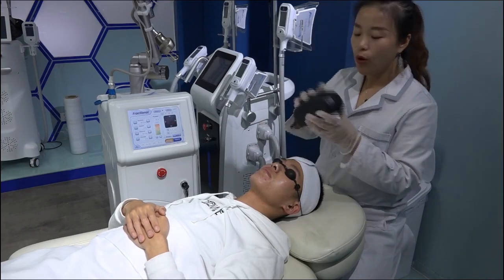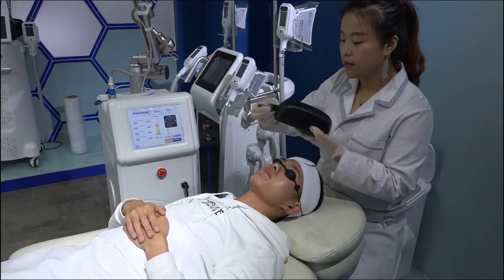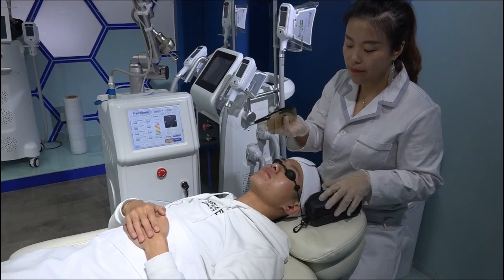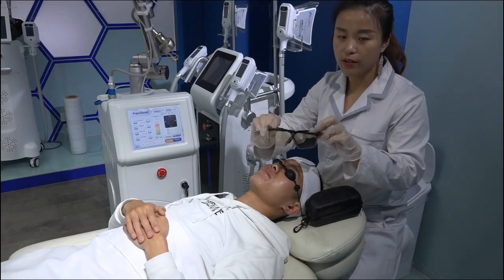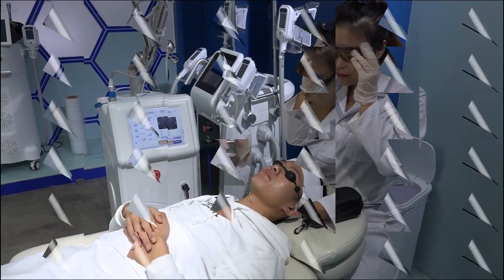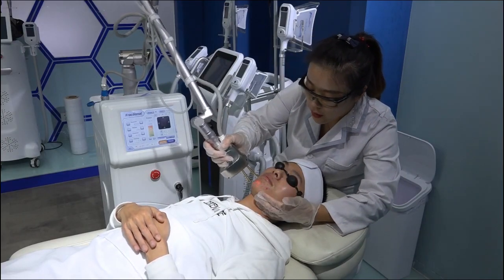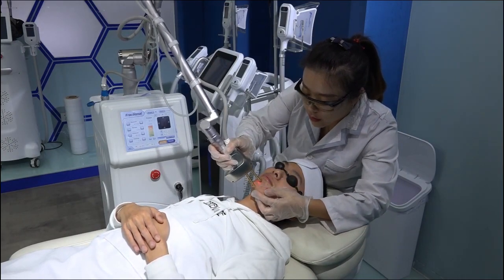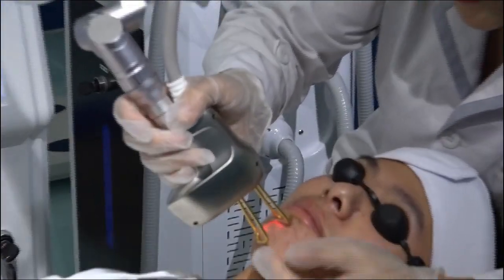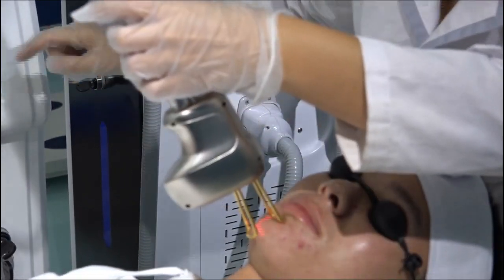Also, we will send you the goggles for CO2 laser with the machine. This one is special for CO2 laser. You can wear this. Because we will do the acne treatment here, you see, we have a light that shows you the treatment area. You can adjust the area. Hold the hand like this. Then you can see.